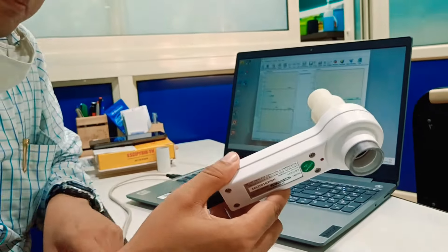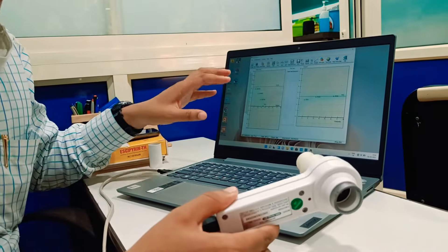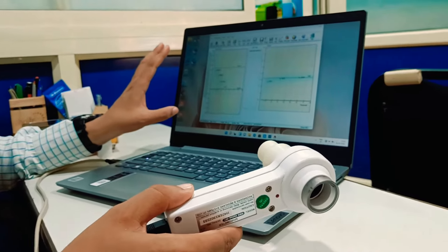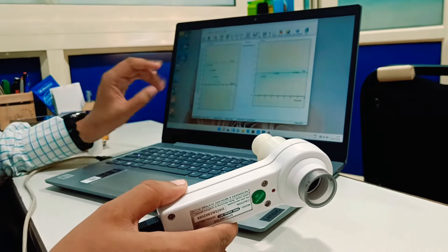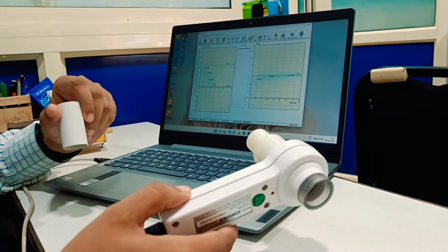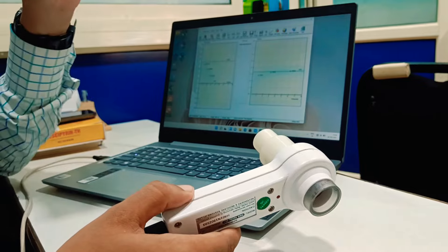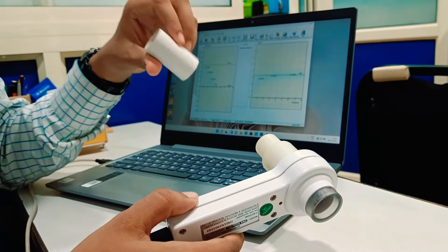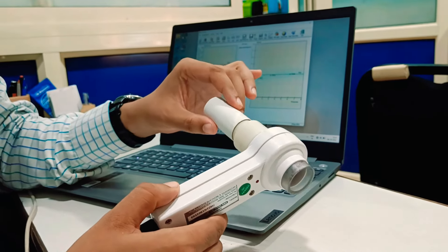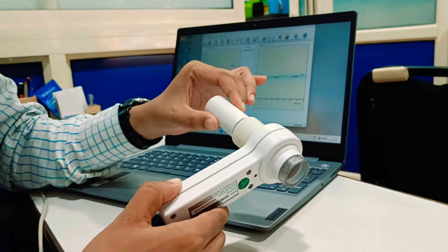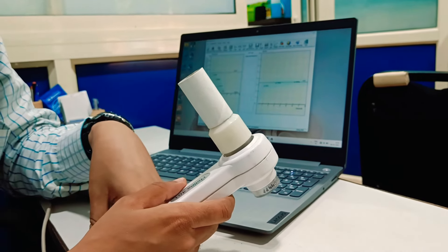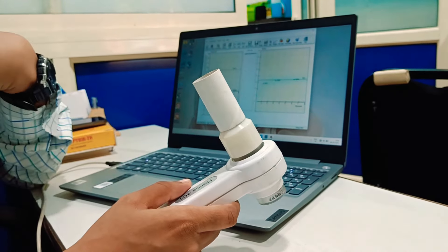This is a spirometer, and this is a connecting cable attached to my laptop. There is software that will do the necessary work. This is a disposable, standardized mouthpiece — we put it here. To begin, you have to inhale first.